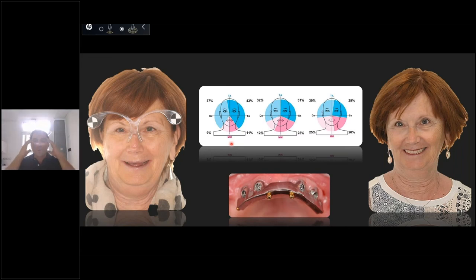I don't want it. I want to improve the work of the masseters, and this is very important for the stability of the occlusion and the good health of the patient. Now, you can see here, and I did something I don't remember now, but it's not important. But in the final result, you can see the masseter is in a good working state, the temporal muscles are working, yes, but I prefer to see on the screen a good cake. I call this image a good cake for this patient.